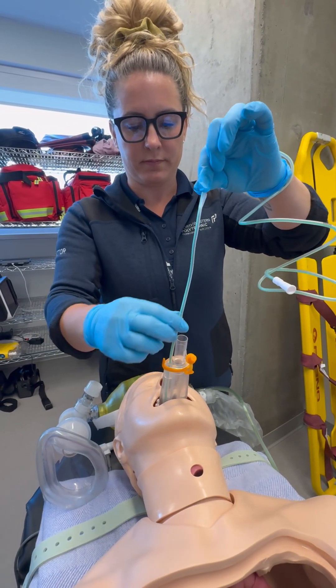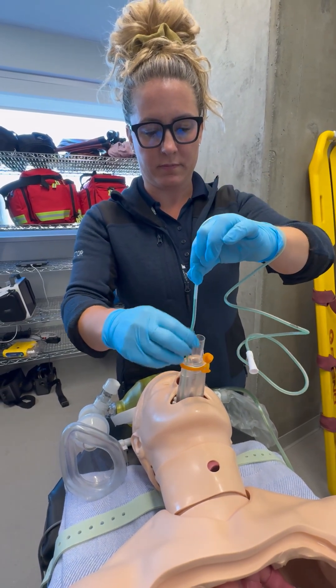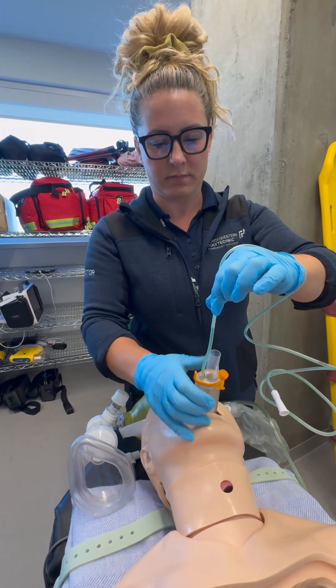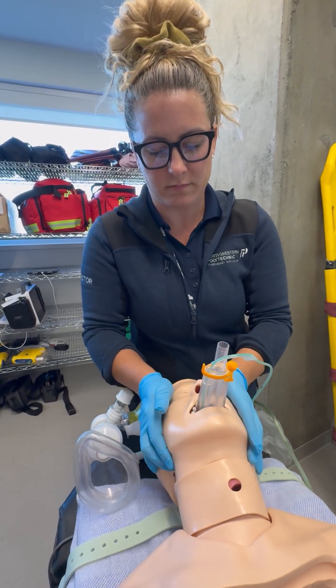Insert the suction catheter through the lubricant and into the gastric channel of the i-gel until the taped depth indicator reaches the outer edge of the channel.